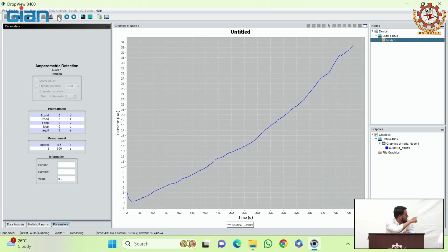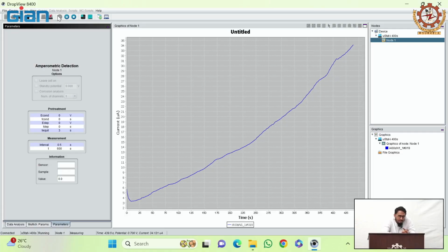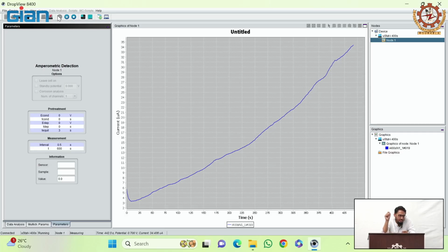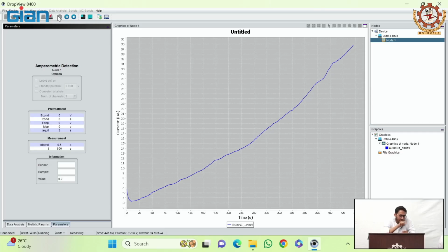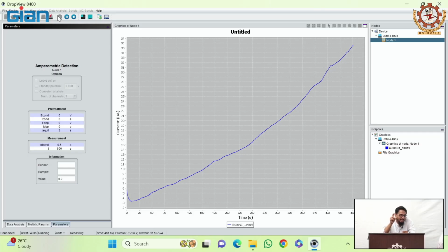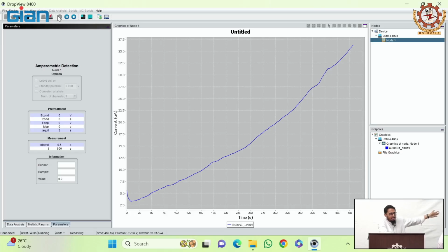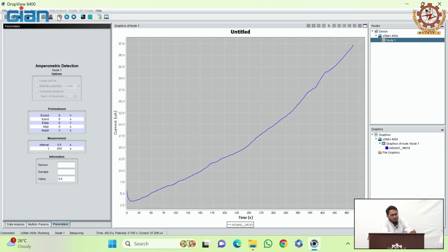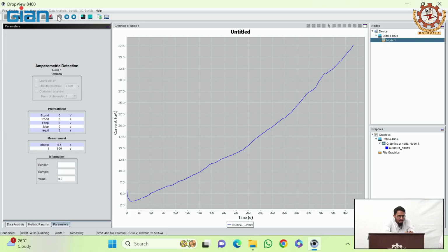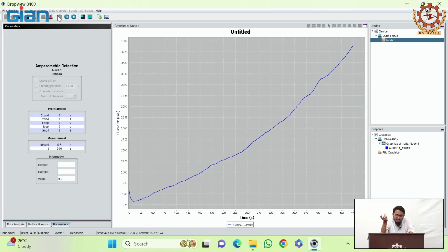So here you can see what is on the y-axis: current, right? During the calibration phase, when we look at the current for different concentrations, we can find a relationship between the current and the glucose concentration. The slope of the straight line will give us the sensitivity. It will tell us how many microamps or nanoamps the current will change per, let's say, 1 millimolar change in concentration. So you get sensitivity in microamps per millimolar or nanoamps per millimolar, and then when you are implanting the sensor and doing the reading, you will get, let's say, x microamps or x nanoamps.